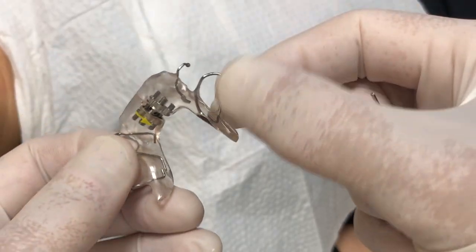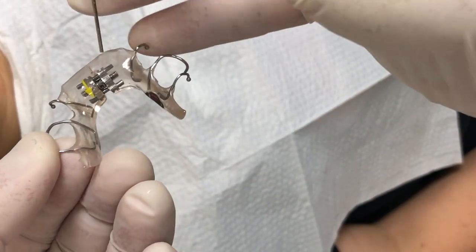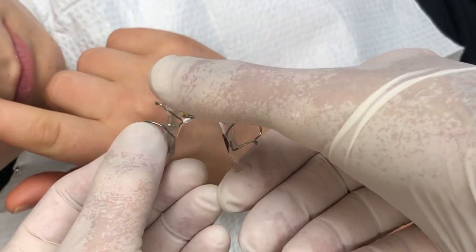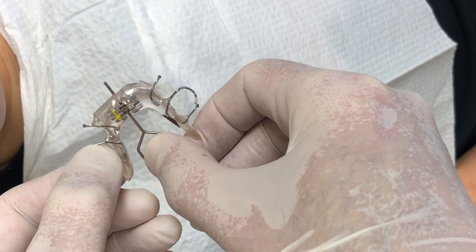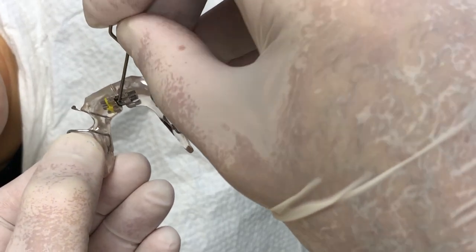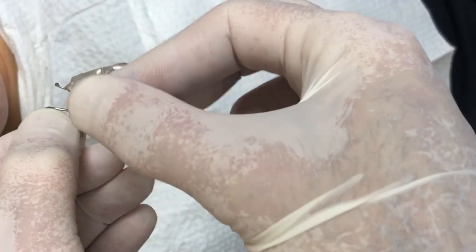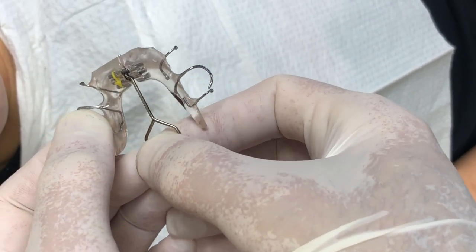This is your appliance. You see the arrow on it? You're going to find the hole — see the hole? It comes out the other end. Now you're gonna turn this in the direction of the arrow — that's one turn. You're gonna do this twice a week. Three days later, find the next hole that comes up from the top, and turn it again in the same direction — that's your second turn. You do this twice a week.